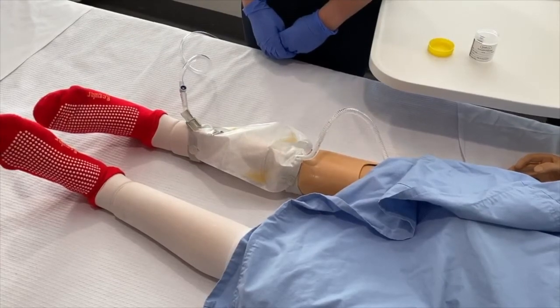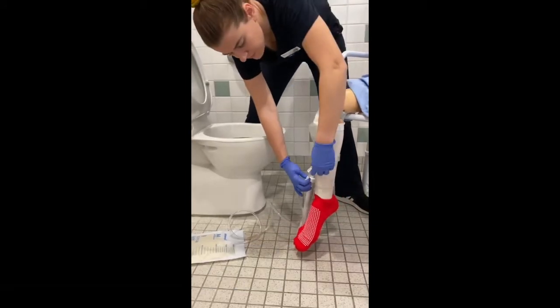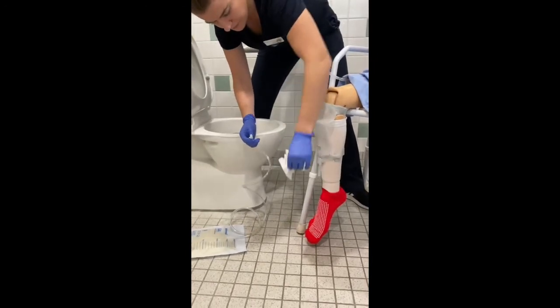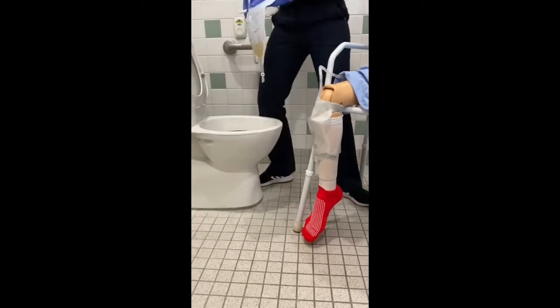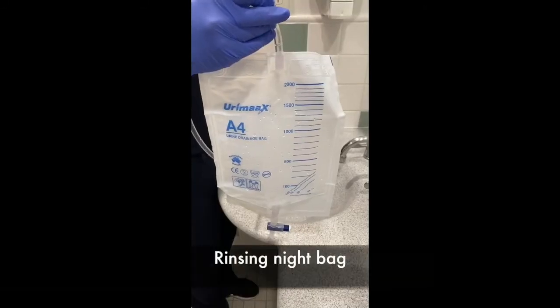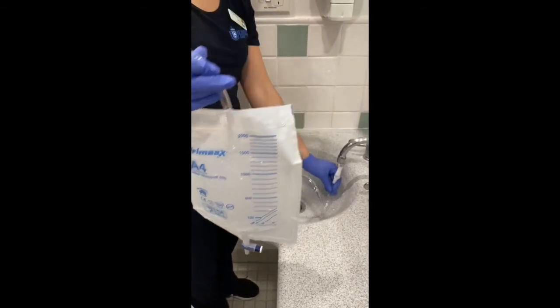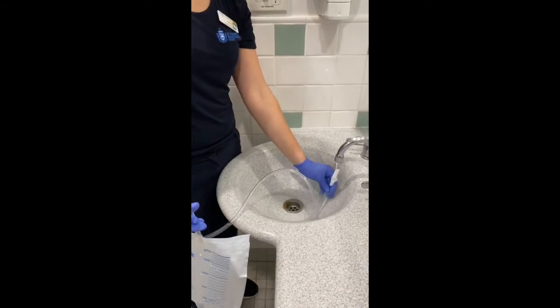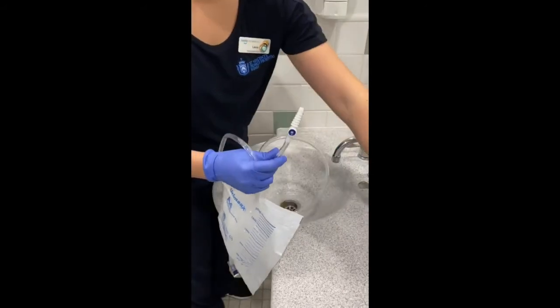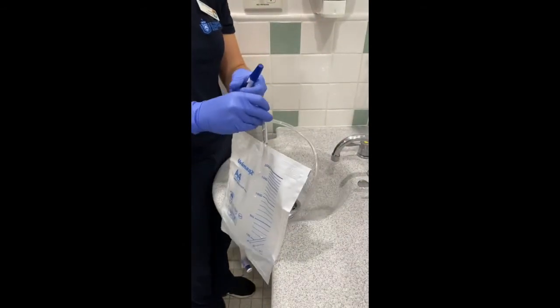Leave the bag on the floor overnight. In the morning, the night bag can be disconnected. Close the tap on the leg bag prior to disconnecting the night bag. Disconnect the bag and then empty the urine into the toilet. Once empty, rinse the night bag with warm water. Reapply the blue cap to the night bag and empty remaining contents into the toilet.